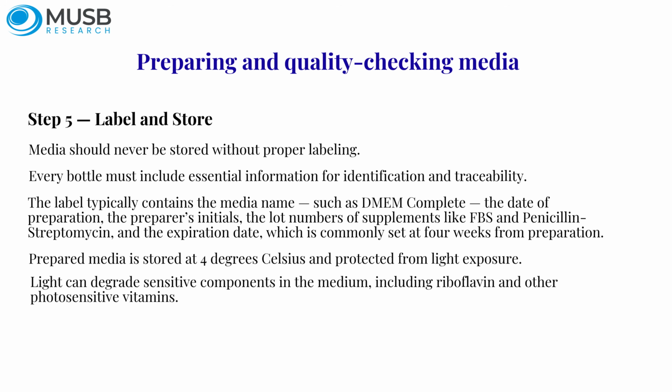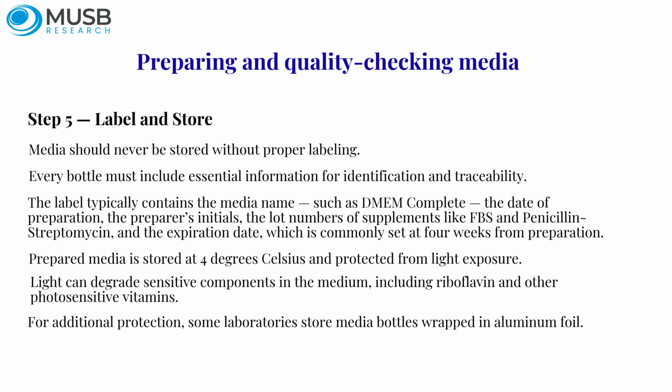Light can degrade sensitive components in the medium, including riboflavin and other photosensitive vitamins. For additional protection, some laboratories store media bottles wrapped in aluminum foil. Quality check: what healthy media looks like.